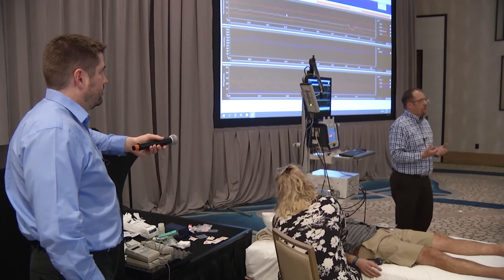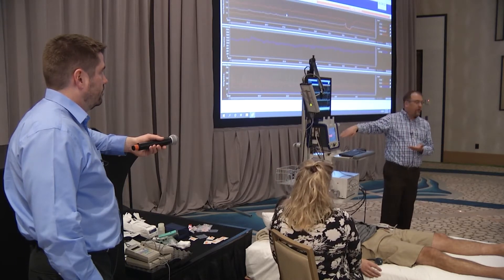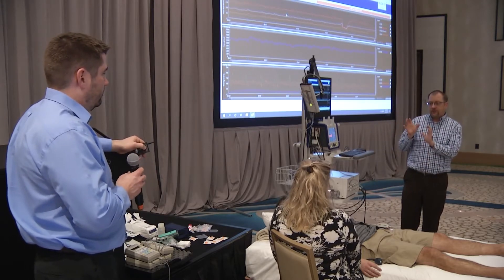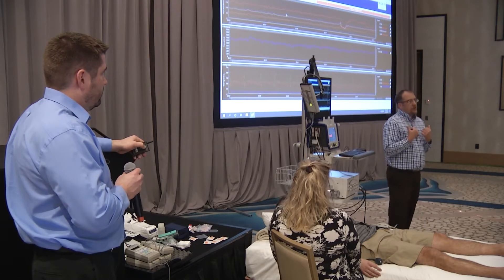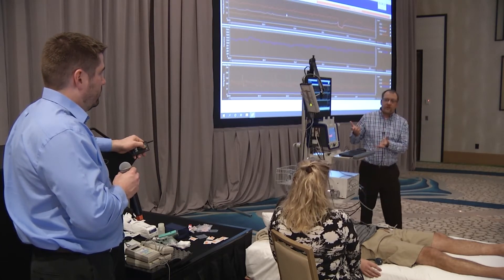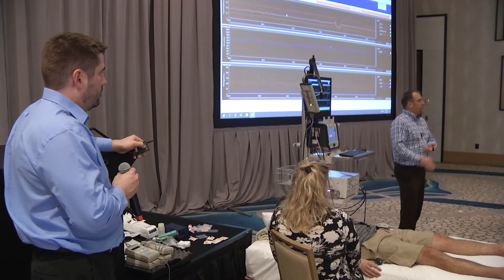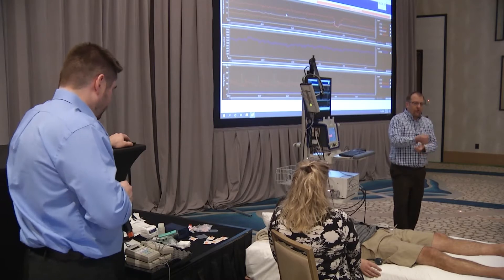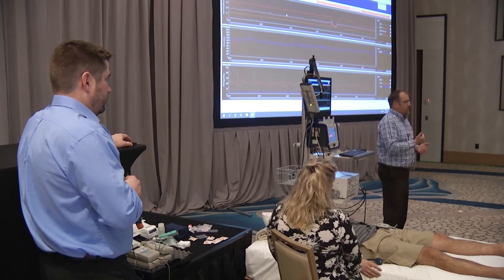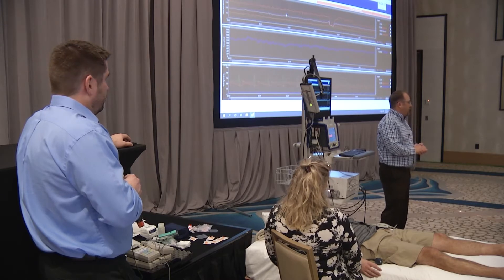Two technicians are extremely important for the head-up tilt. One person has the clipboard, recording manual blood pressures and comparing them to device readings while also noting heart rate and symptoms. The other technician takes blood pressures and watches the patient for skin color changes or visual cues of a blood pressure drop. That second technician also writes down values, controls the foot pedal or remote to tilt the table, and manages data collection — it can get hectic, especially when you're seeing a large blood pressure drop in orthostatic hypotension patients.